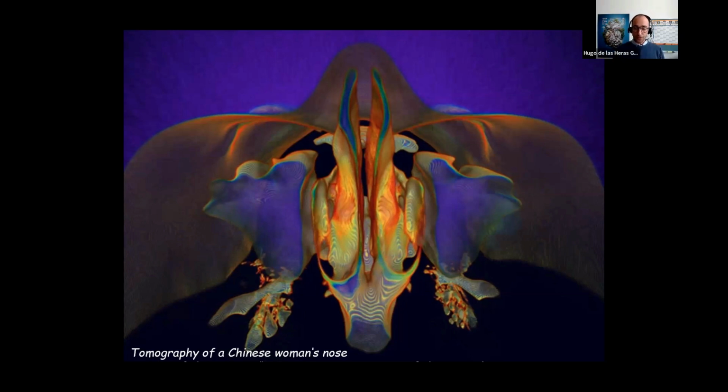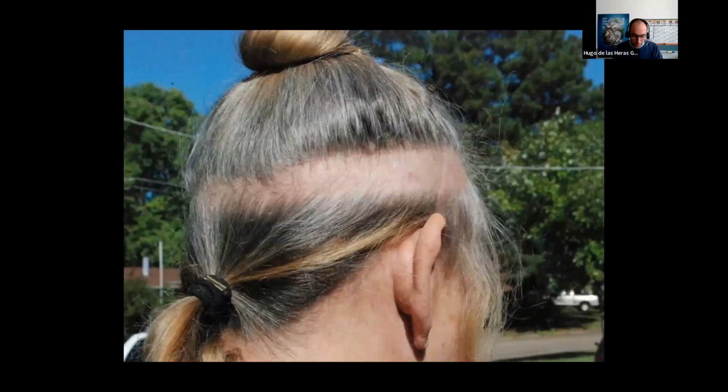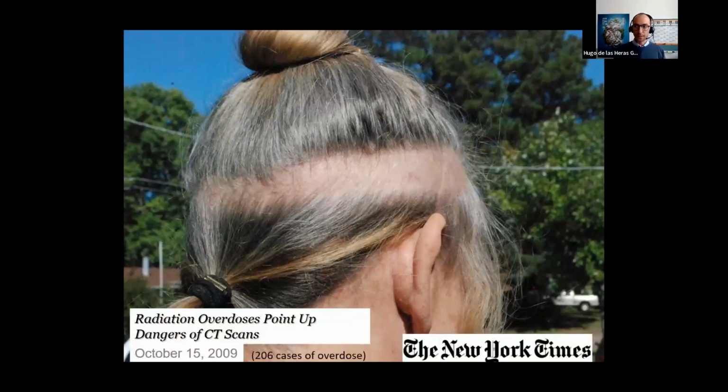Because if we lose control of the quality of the images and we don't have certain assurance methods, we can have problems like we had during the time I was working at the FDA in 2009. There were something like 206 cases of overdose from one CT in a clinic in California. People were getting a scan of their head, called a perfusion scan, and they were losing hair in that stripe after a few days, something like 1 week.